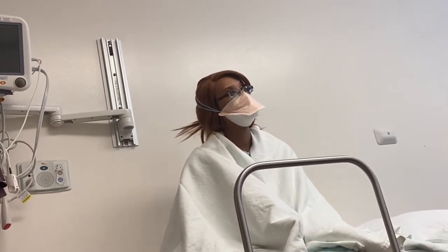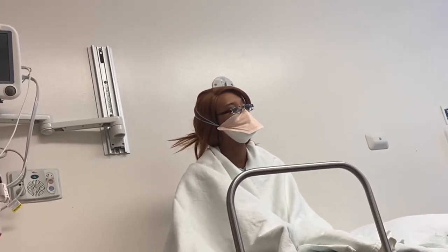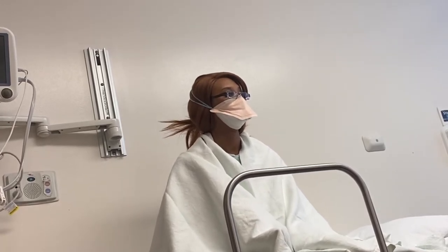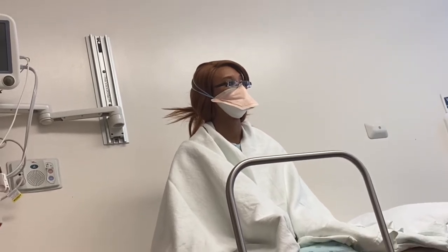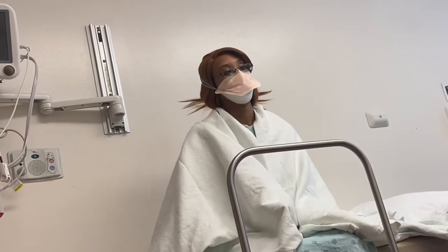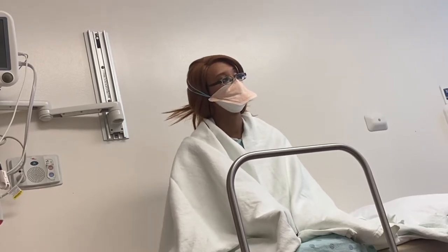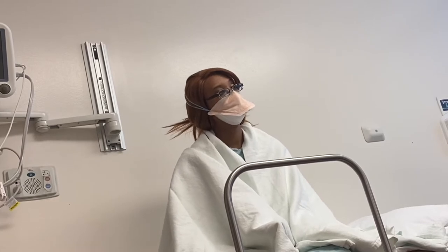Oh, and I have a little small hiatal hernia. You got a hiatal hernia too. So will that affect it? We make sure we can have it nice and straight so we put it in a good position for that. Sometimes a patient says when they have a hernia, they can feel the tube move up and down, if your hernia is sliding. And so you might feel that with the overnight one. It's normal. Just know it does not interfere with your breathing, because the end of the tube is in your stomach. Okay? Oh, okay. So it doesn't go to the lungs, it's in your stomach.